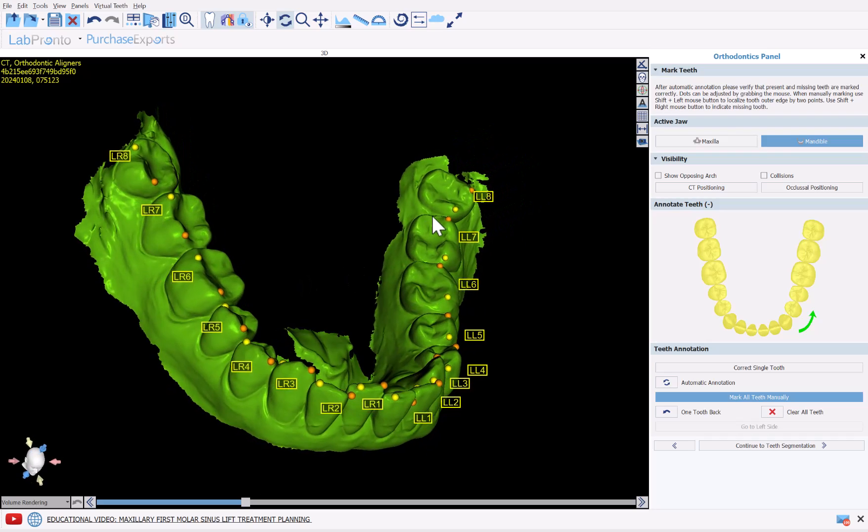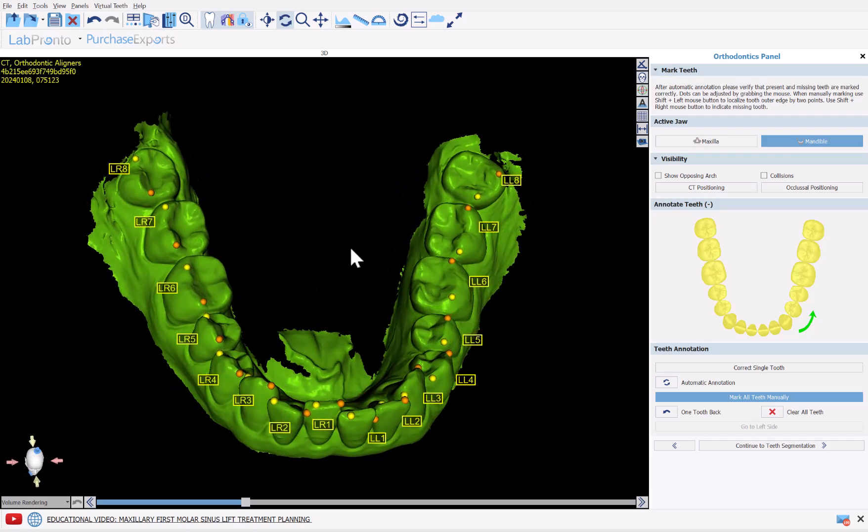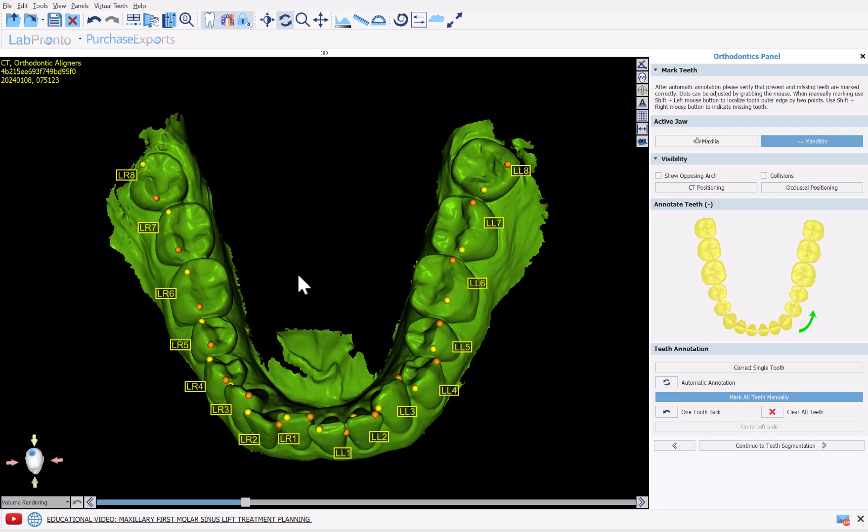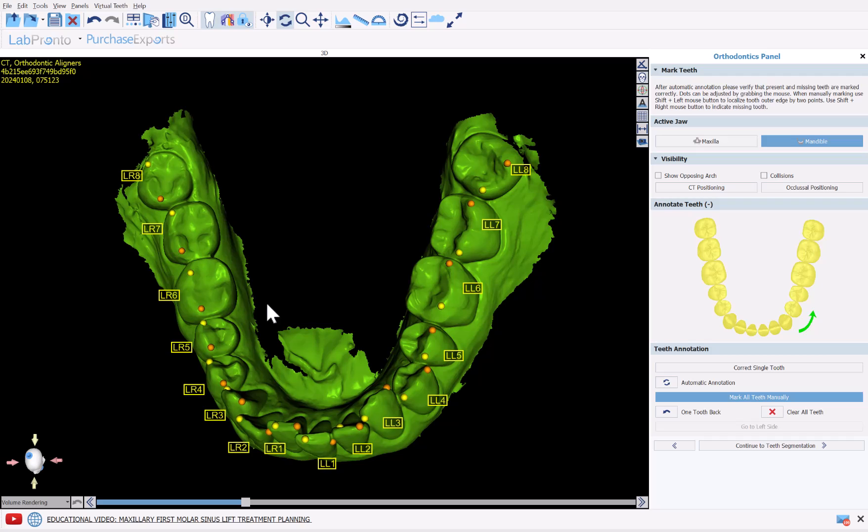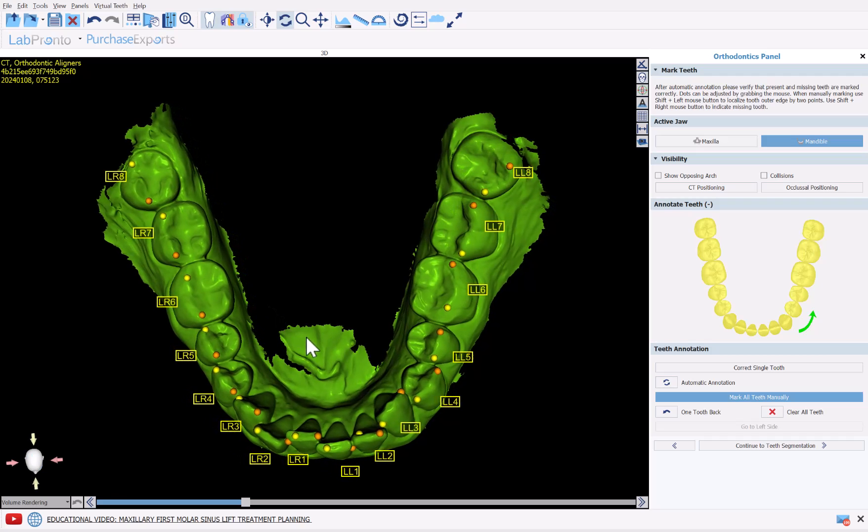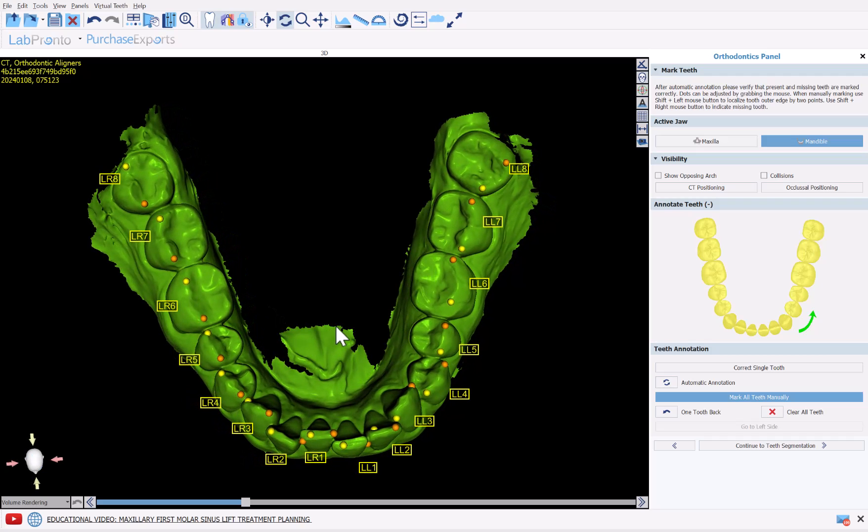We can now review the annotation and identification of the teeth for the mandible. After confirming that everything is correct and OK, simply click Continue to Teeth Segmentation.